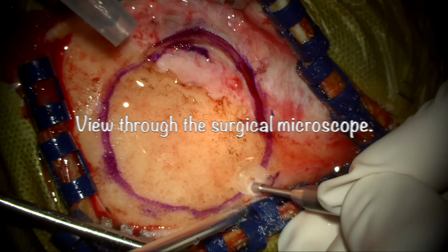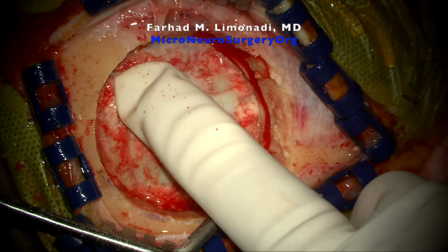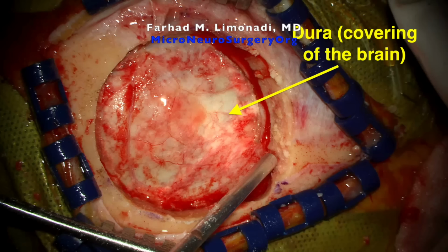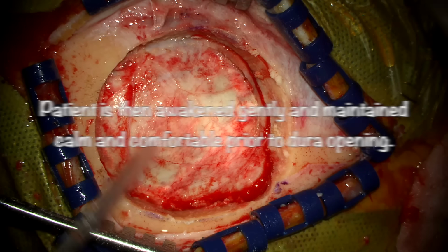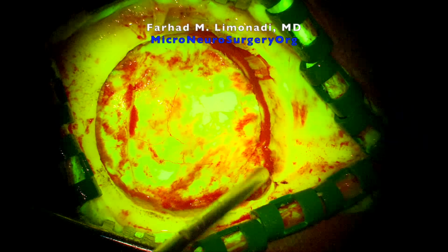While patient is completely sedated, a bone flap is raised over left frontoparietal region overlying the tumor. Patient is then awakened gently and maintained calm and comfortable prior to dura opening.